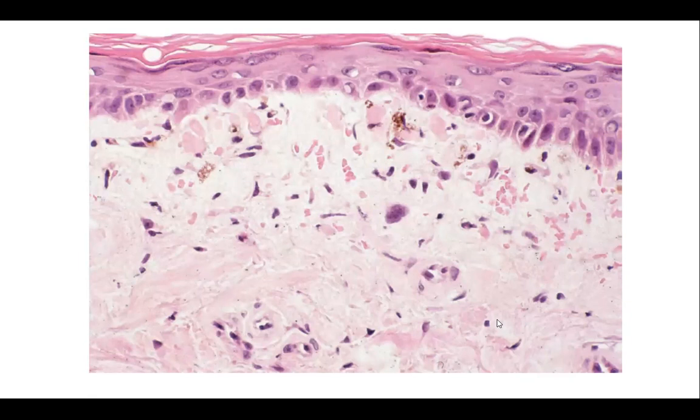So what do we see here? What features? Can anyone describe to me the epidermal and dermal features? Where is Amy Huang? She disappeared. Hi, there's a basal layer atypia, I think, and extravasation. Well, maybe some hemosiderin. Yeah, how thick does the epidermis look? Atrophic epidermis, and what we see here is colloid and civatte bodies that imply what has happened here before. Maybe it's like a burnt out something. So it's probably an interface dermatitis, right?